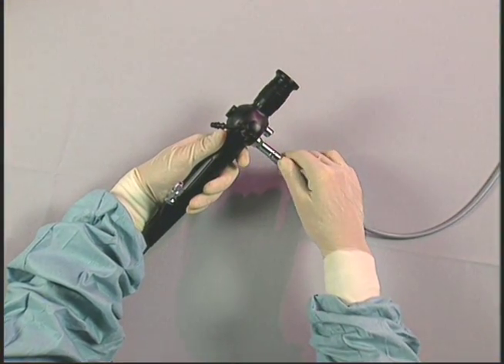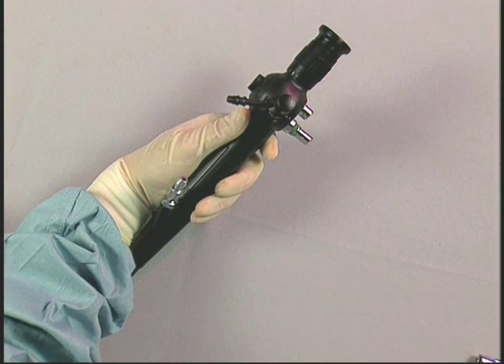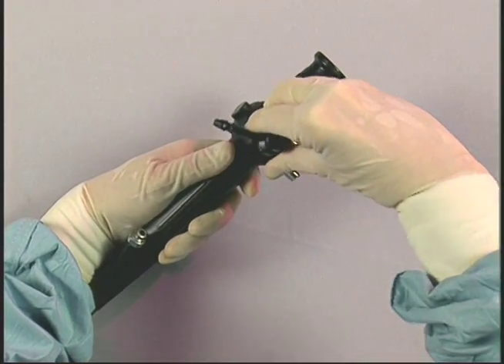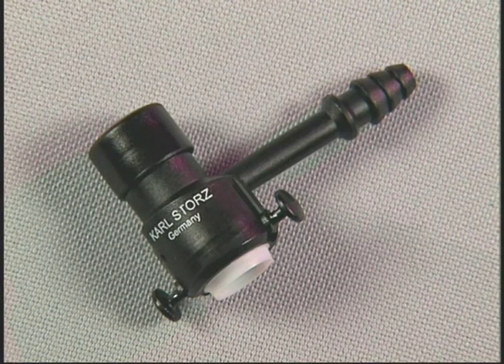Remove and disassemble any accessories from the endoscope: the light cord from the light post, and any adapters attached to the distal working channel. Remove and discard the disposable suction valve attached to the proximal working channel. This valve is a disposable, sterile, single patient use item.